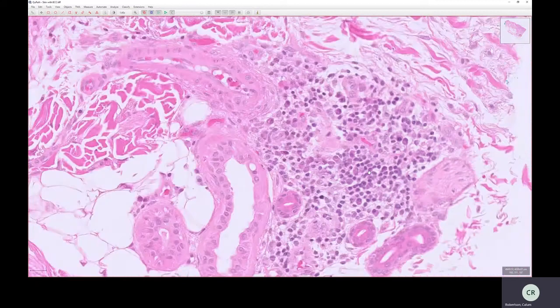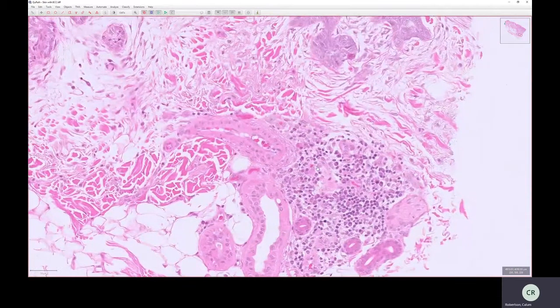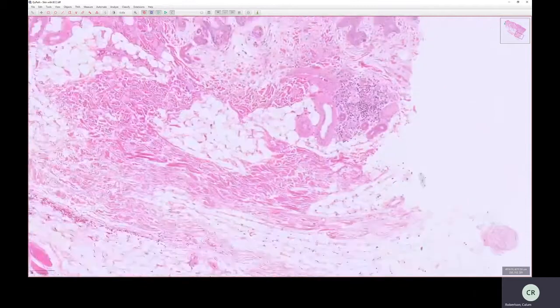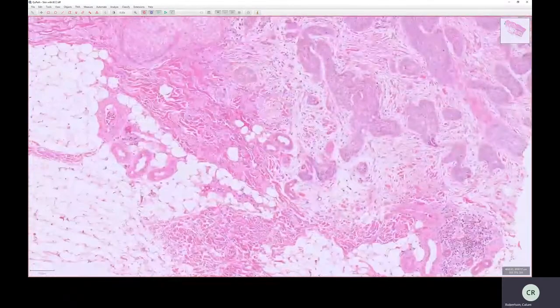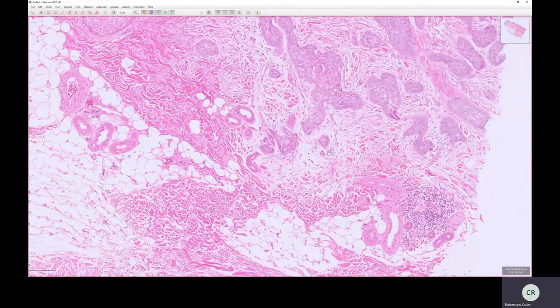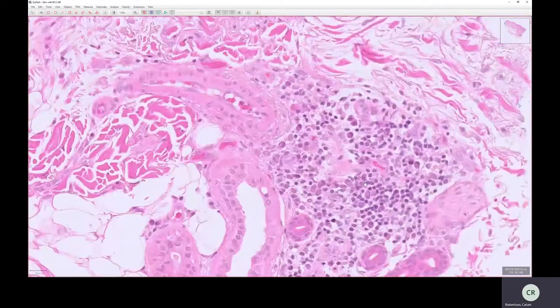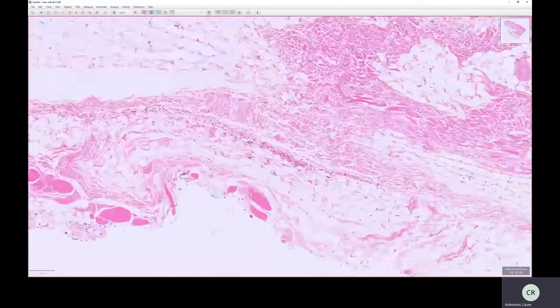And you see them quite often in tissue sections of various types. They can be very useful in that a lot of diagnoses can hang on your observation of plasma cells. They're a useful thing to be able to identify. So we've identified red blood cells, lymphocytes, plasma cells. The next thing we should look for is another inflammatory cell, which is not part of the chronic inflammatory cell group.